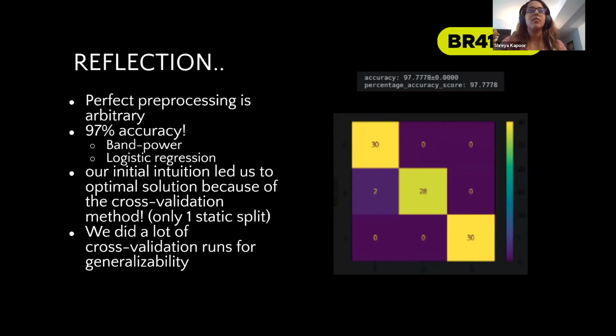And going to reflection first, it was really hard to think of how the data is organized and how the pre-processing could impact the accuracy, and what filtering even means. But we had an idea that generally in machine learning, you would use a lot of hyperparameter optimization and try different techniques. That's why we worked on as many solutions as possible and tried to combine them.